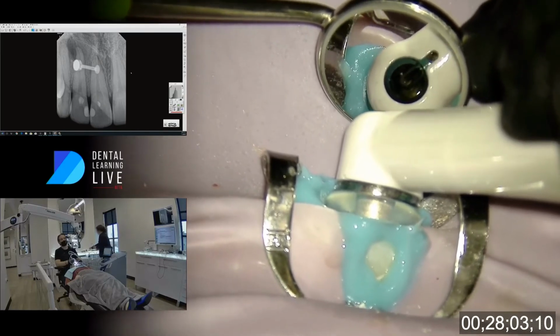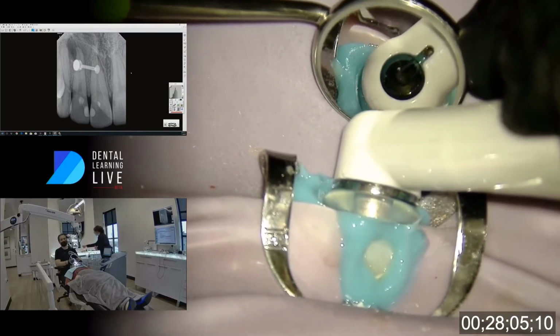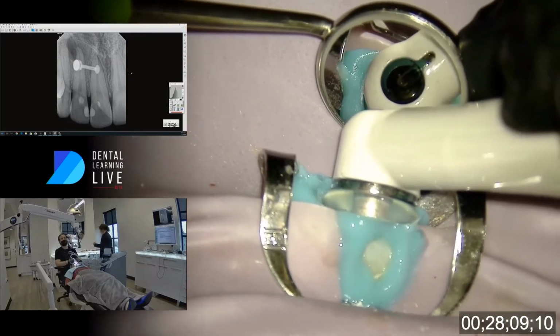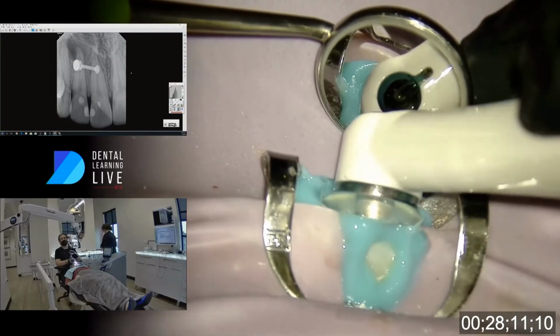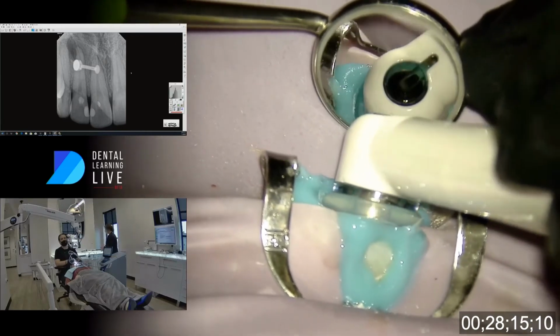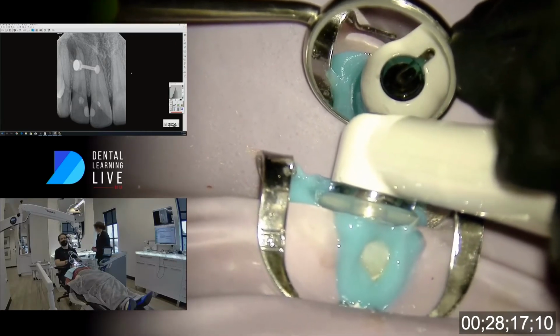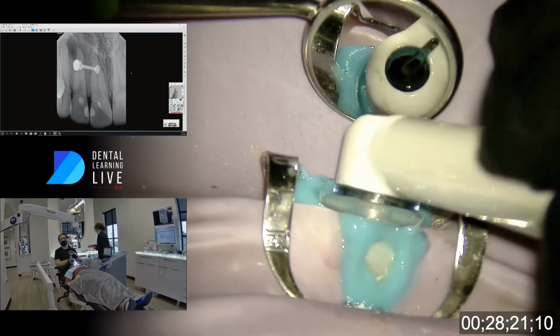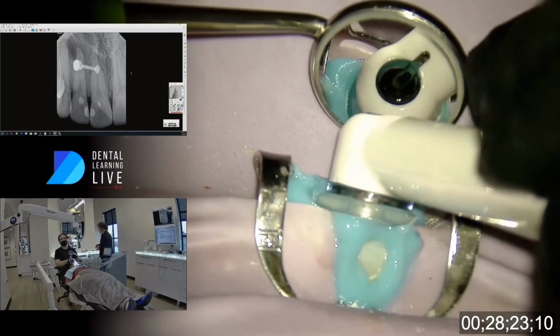Just about done, 30 seconds. And again, if there's a lot of movement or if your handpiece is wiggling around, sometimes you can break a seal, but when you're really perpendicular and parallel down the canal, this seal is pretty stout. I'm wiggling it around and it's still dancing in the same spot, which is a great sign.